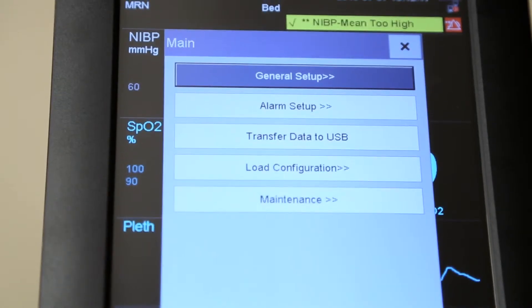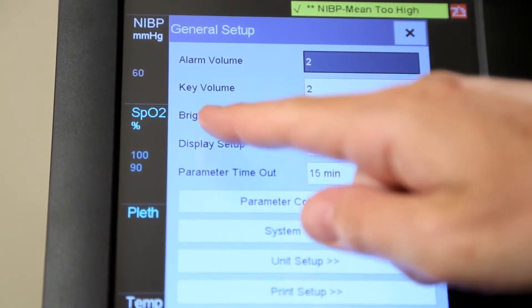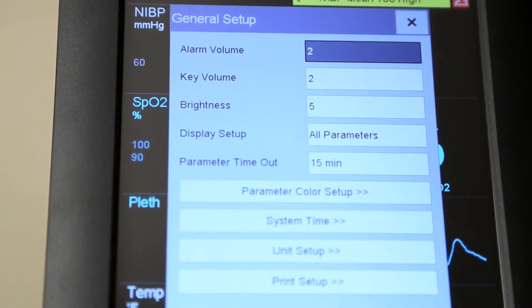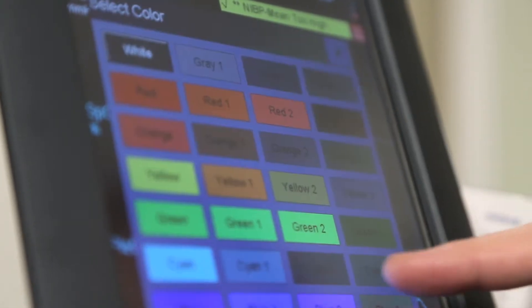Touch the main soft key to set up your Rosie 4. You can select different settings such as language, brightness, date and time, department, alarm volume, and key volume. You can also set up your display parameters, colors, and units.